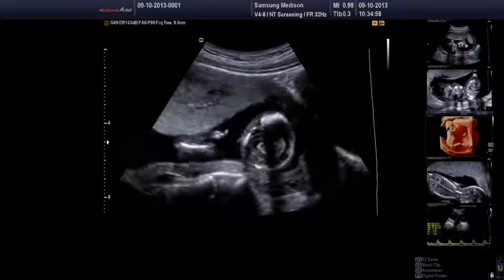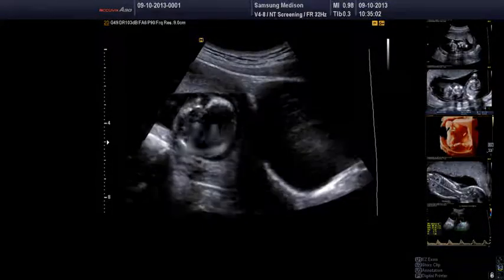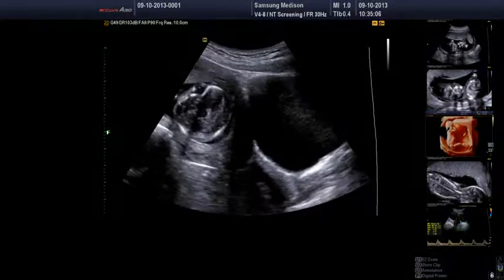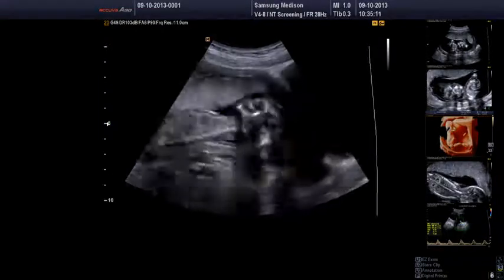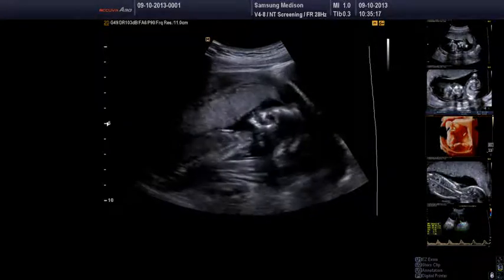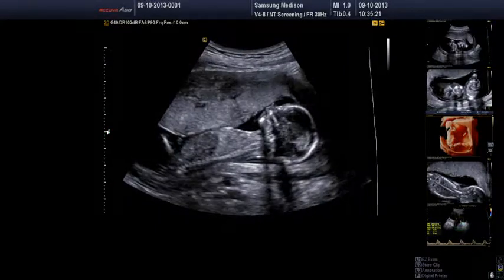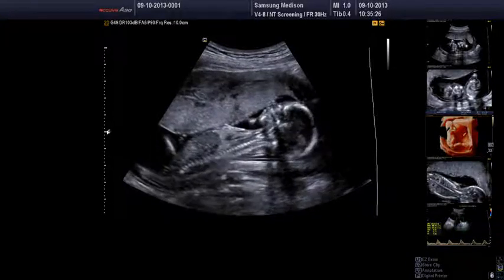Just to show you first, this is a midline sagittal section of mum, so you can see the bladder there. We might just change the depth for a moment so you can see the cervix down the bottom of the screen there. And then we've got our fetus here. It's actually a little bit big for first trimester screening. It's actually 14 weeks, but we'll come back to that in a moment. You can see the placenta's anterior. You can obviously see the heart beating nicely there in the middle of the screen.